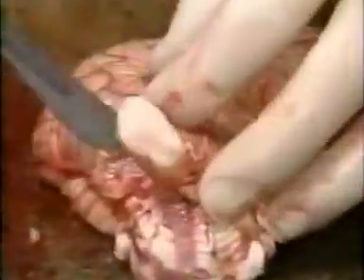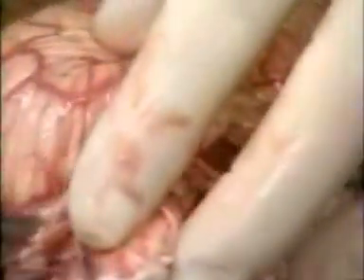She's now dissecting off the brainstem from the cerebellum, cutting the cerebellar peduncles.